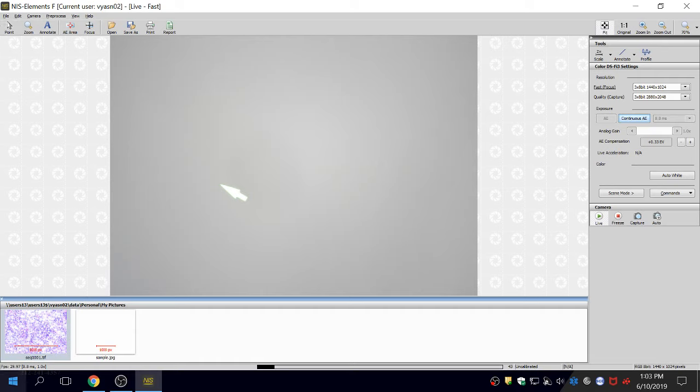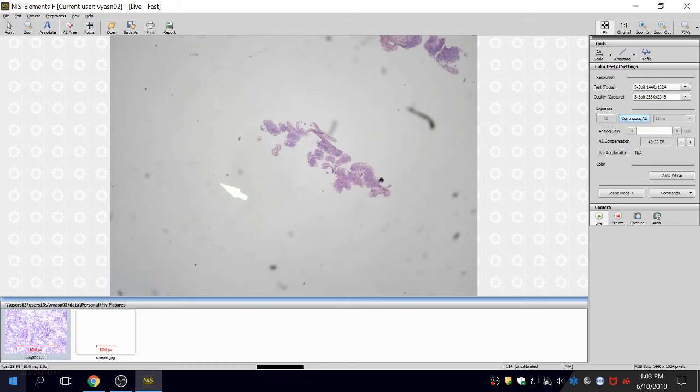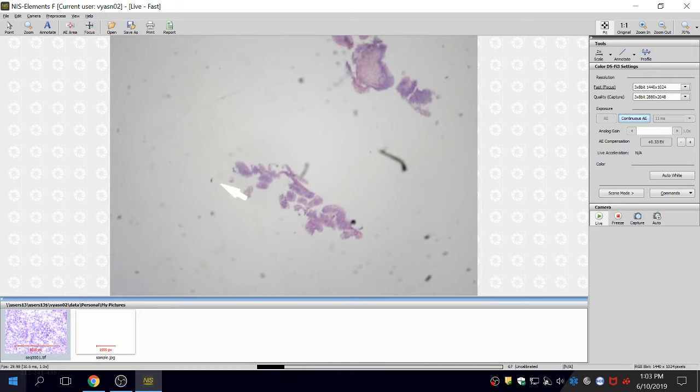First one is a 65-year-old male with a bladder mass. Then we did a bladder biopsy. So this is low power. What we saw here, the first thing we know is a papillary lesion. Dr. Heinz gave a lot for me to remember about the bladder.